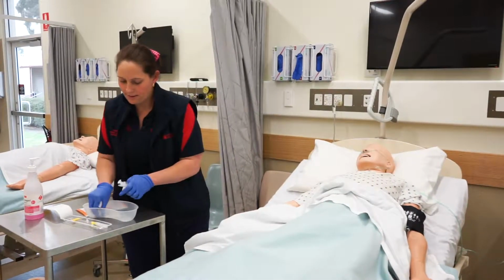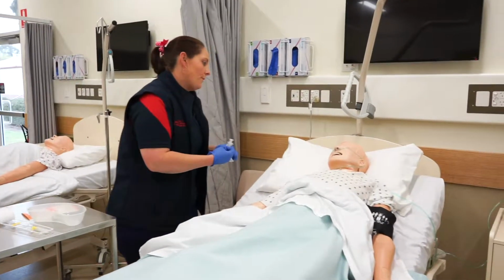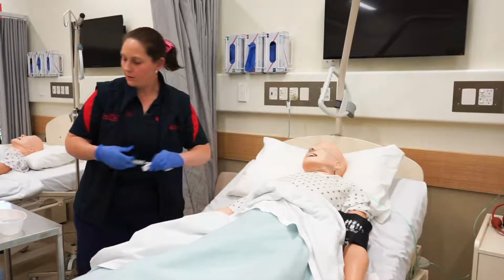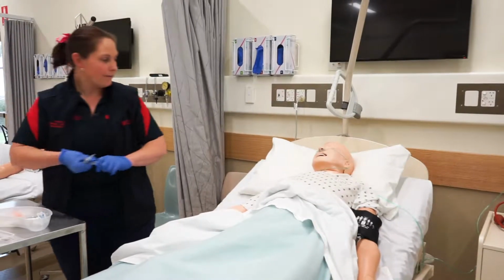So I'll just gain some consent off the patient. I've already spoke to Seeth before. So Seeth, this is just the needle I was telling you about that we're going to put into your abdomen. Are you still okay with that?